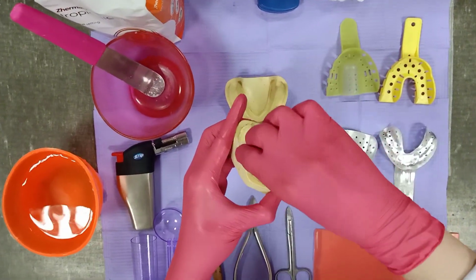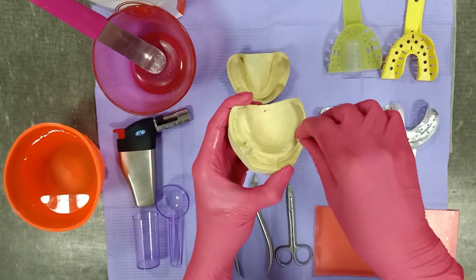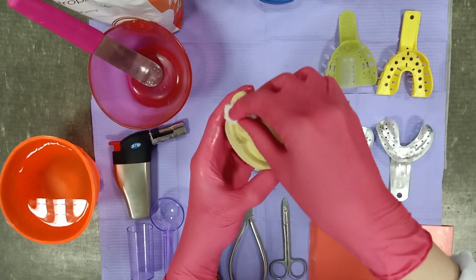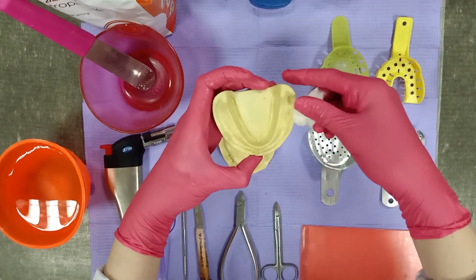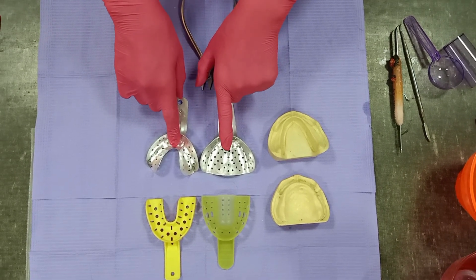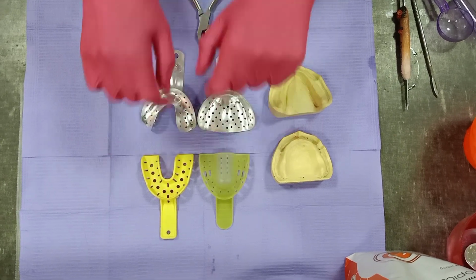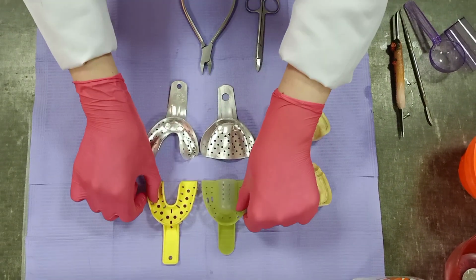First of all, paint your cast with Vaseline to act as a separating medium before you take the impression. The lower cast and the upper cast. After that, you have to select the proper size of stock tray, either plastic or aluminum. We are going to use the aluminum stock trays.